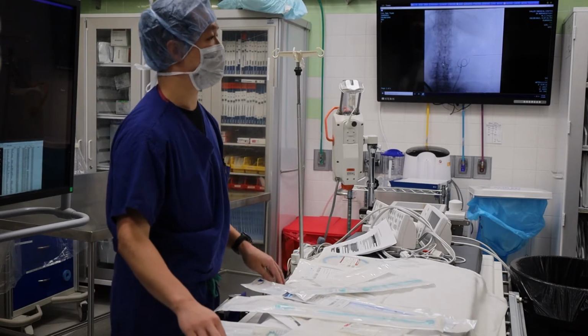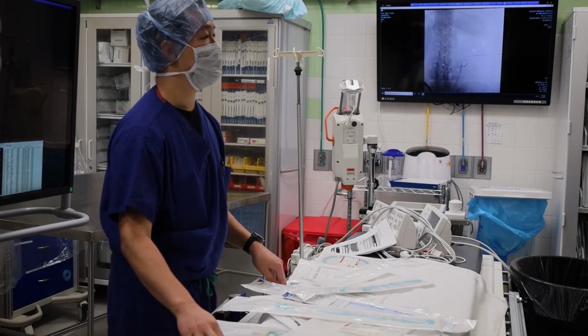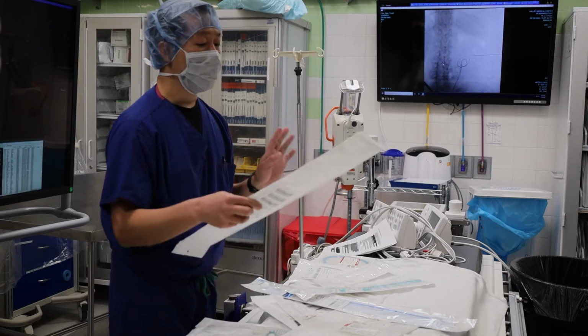People have died during percutaneous nephrostomies. People have coded afterwards and gotten septic shock, and it's unfortunate. And we definitely try to prevent that from happening. Okay, so this goes in.